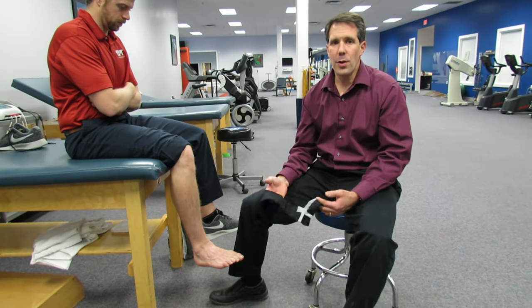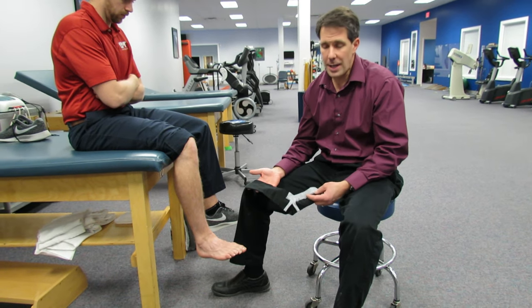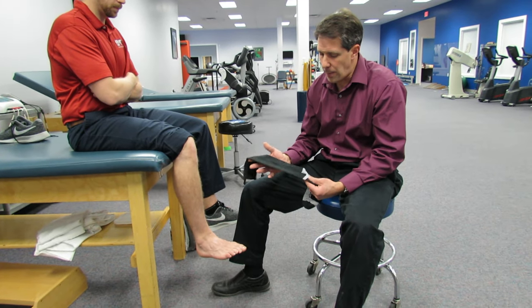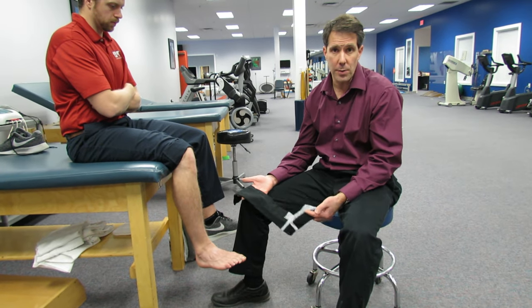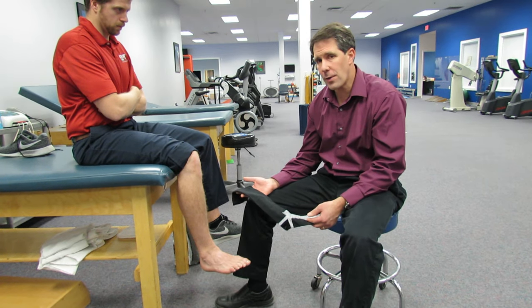Hello everyone. I know that all of you at some point or another have had some difficulty putting on a compression sock, either as a practitioner putting it on or as a patient putting it on themselves. I just want to show you how we put on this easy glider sock. Some of these come in no compression, some 10 to 12 millimeters of mercury, and others 18 to 20 millimeters of mercury — and they can be quite difficult to put on.